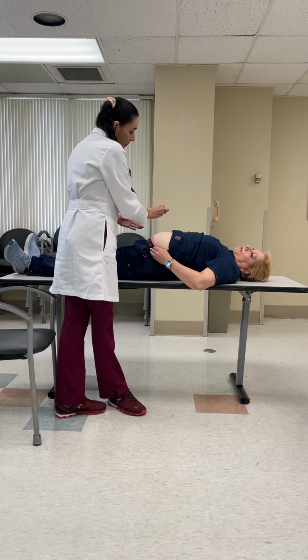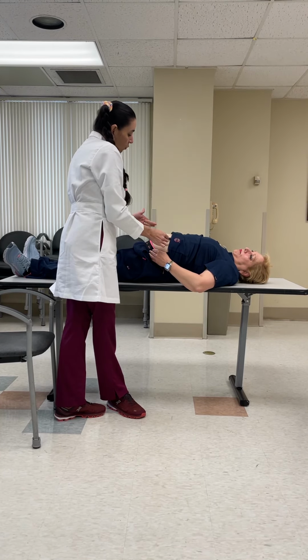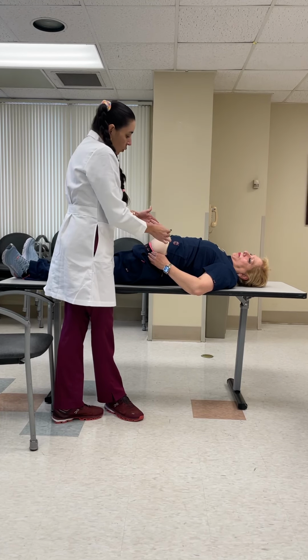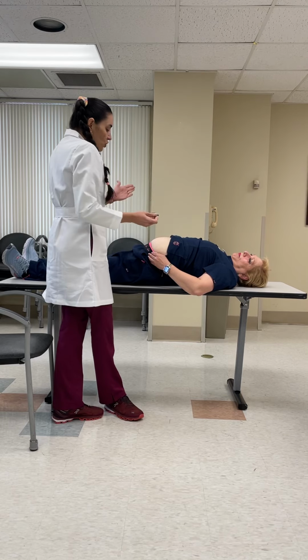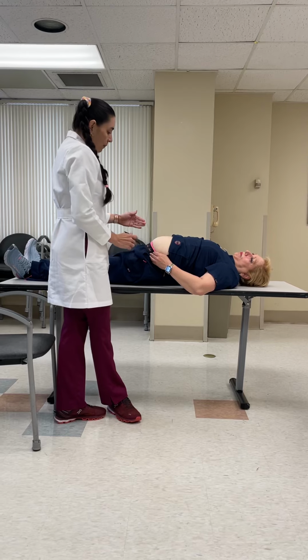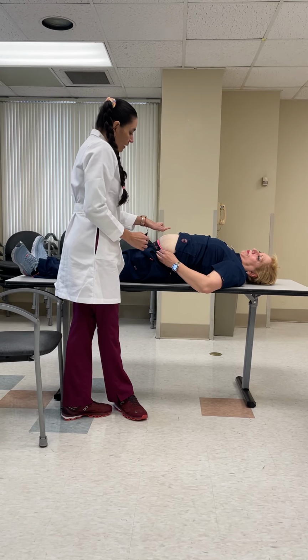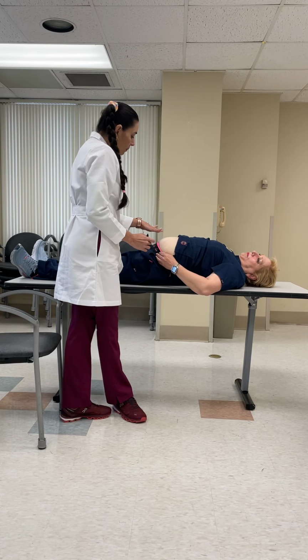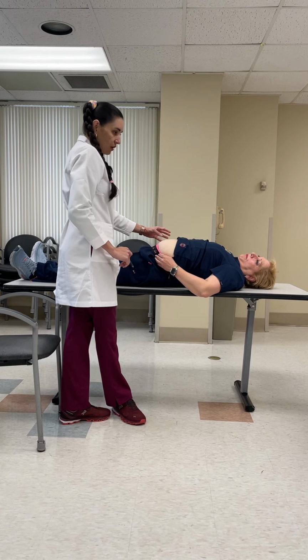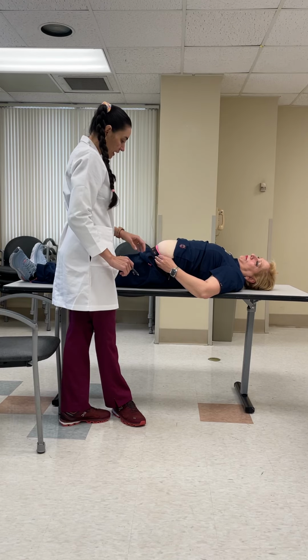So you can go again and set up the limits of the rectus abdominis. Besides that, you can divide the abdomen into four quadrants: right upper, right lower, left lower, and left upper. You want to make sure that you understand where you want to place the stoma site. Usually it's going to be two inches below the umbilical line or the belt line, on the right if it's an ileostomy, and on the left side if it's a colostomy.